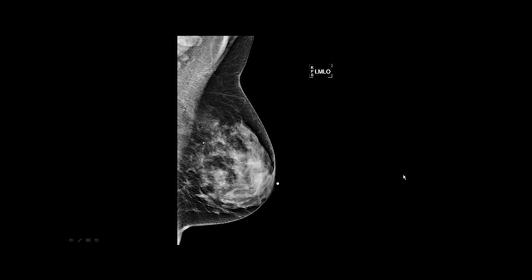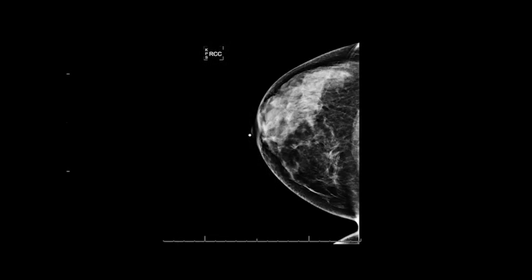It's something. And remember, you can't just pass an image. They do have radiologists that read it. So if there's something in the image to be called back, they'll read it and call and give you a deficiency on that because there's something in the breast that's of concern. So they do have radiologists that read these images.